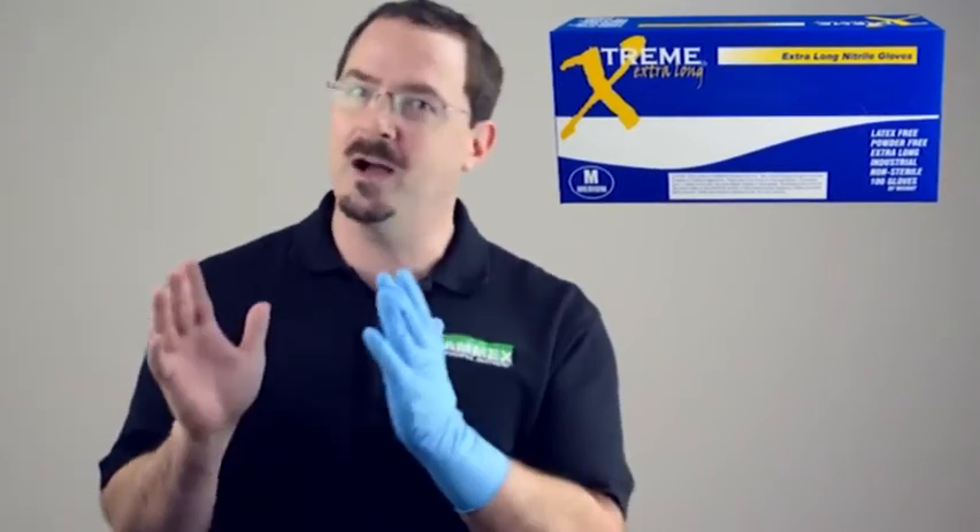They are available in a variety of sizes from small to extra large, and sold 100 gloves per box and 10 boxes per case. That's the Xtreme Extra Long Nitrile Glove by Amex.